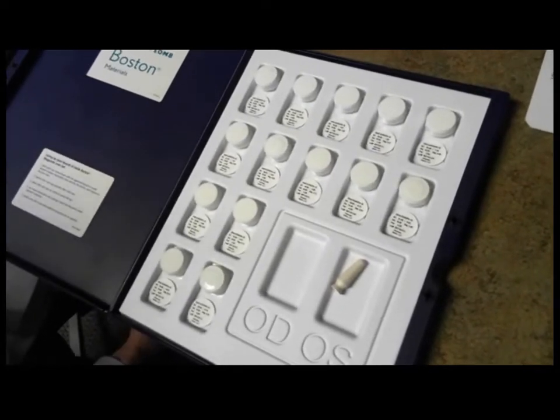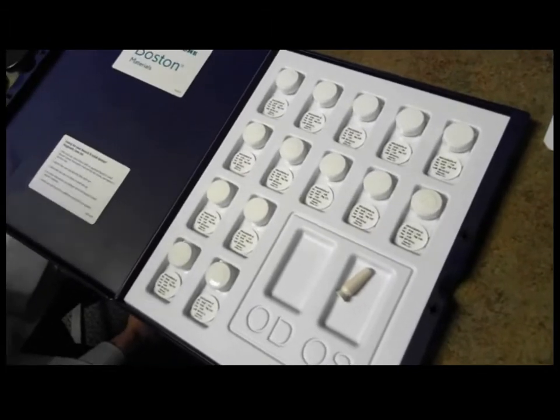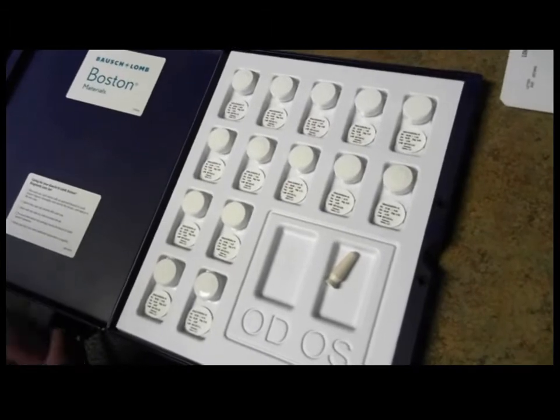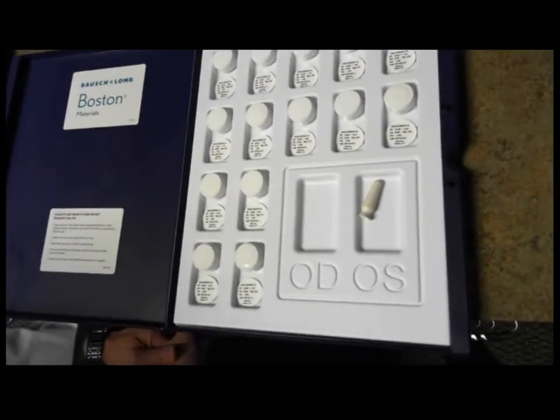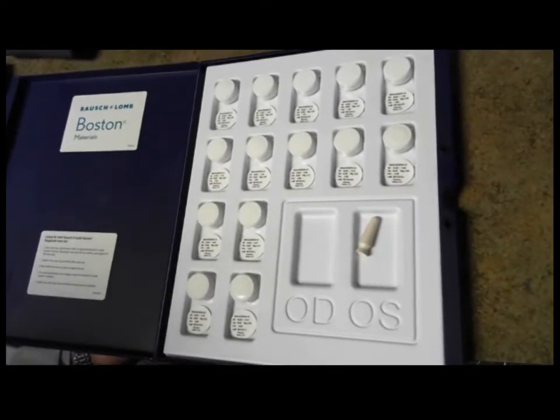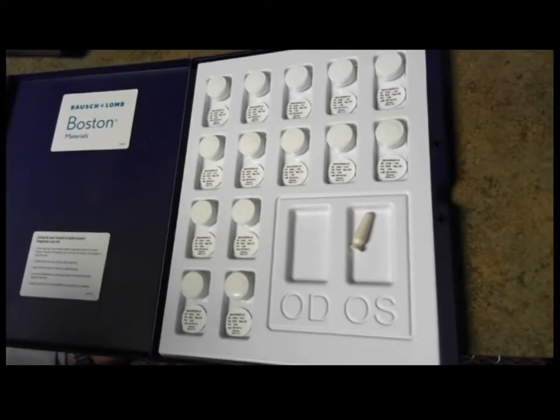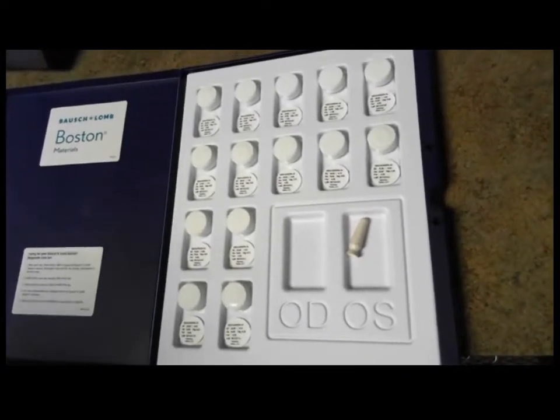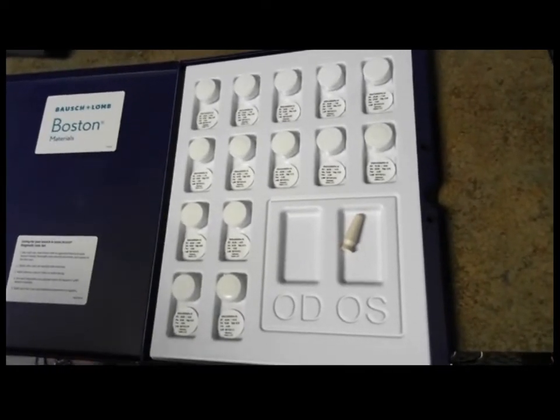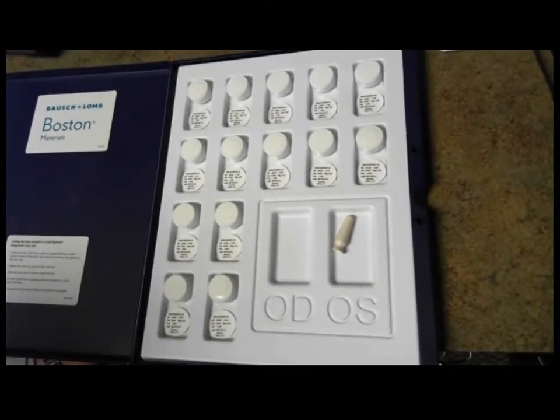Now, with a patient with Salzmann's nodular degeneration, I want to have a fairly large lens so that we will be able to span the entire cornea and we're not landing on the limbus. That's going to be very important for any raised areas that we're trying to get above. Most oftentimes I'm using a standard Europa, but then I'm going to customize it. And most likely what we're going to do today is increase the optical zone of these lenses to completely clear any nodules that may be in the periphery.